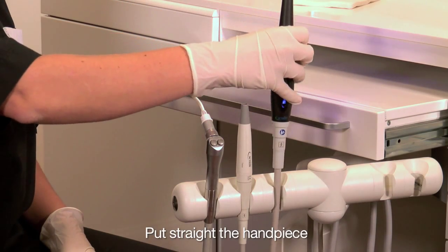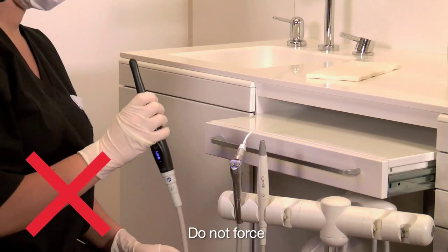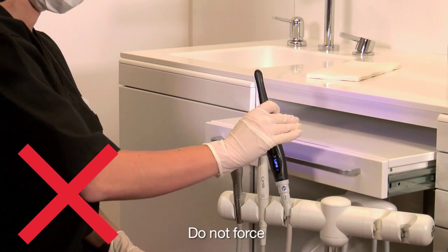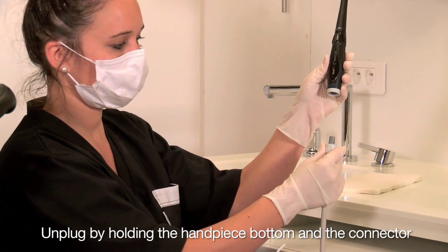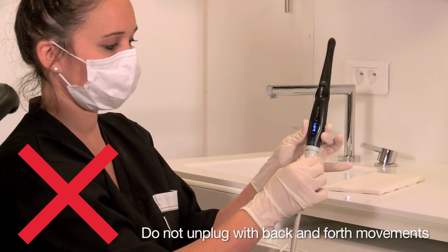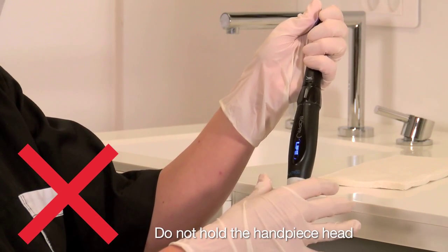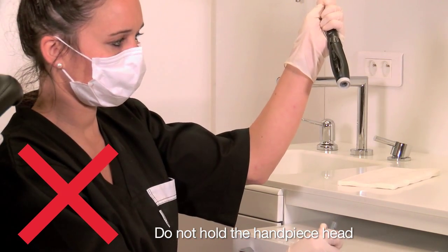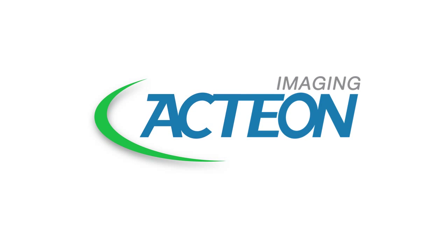Turn the camera handpiece off. Do not take the camera handpiece out sideways. Unplug the camera handpiece by holding the connector at the bottom of the camera handpiece. Do not unplug with back and forth movements on either side. Do not pull the connector out by holding the head of the camera handpiece. Do not use the connector in the middle of the camera or rotate the camera handpiece.